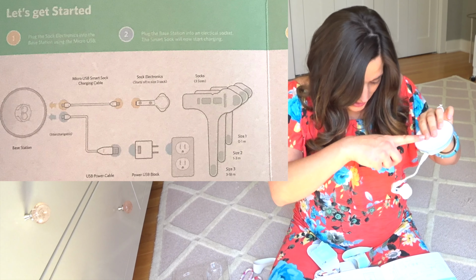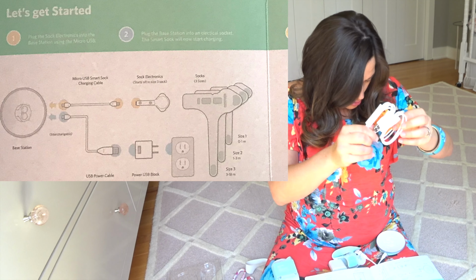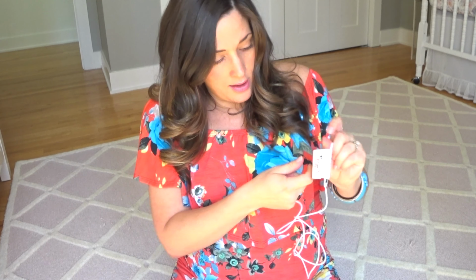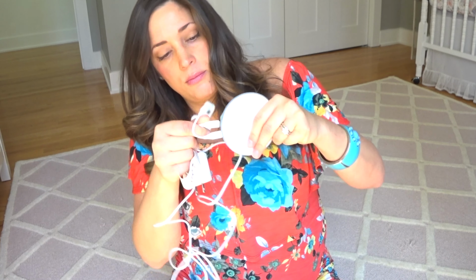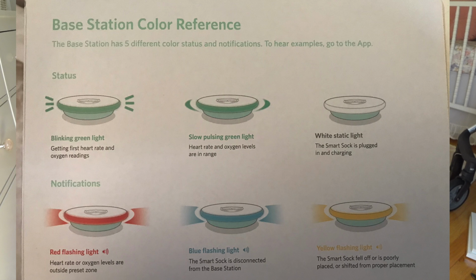Step 2 is plug the base station into an electrical socket, with the USB power cable and the USB power block. So that fits in there, and then that goes into the base station. And then I will plug this up to charge it. Just plugged it in, it turned blue and then white. Oh, here it is. There's a base station color reference. White static light means it is plugged in and charging, so that's what it's doing right now.